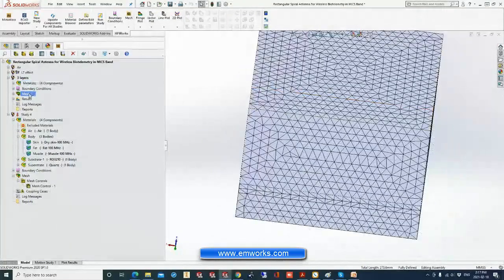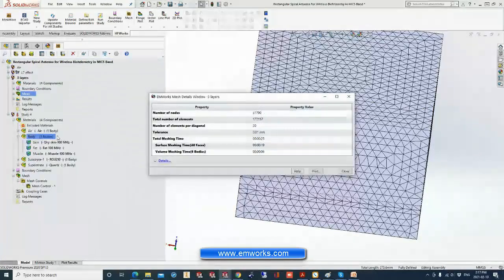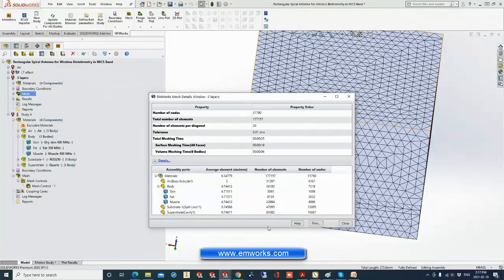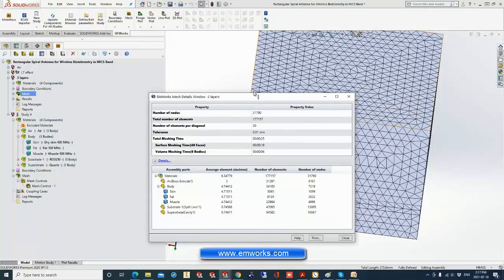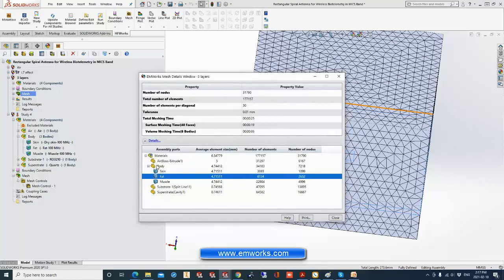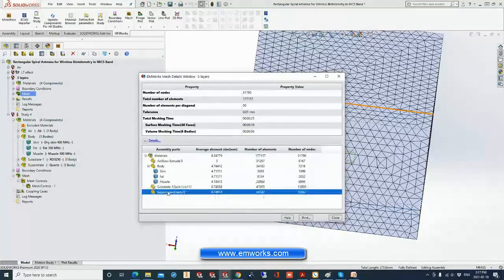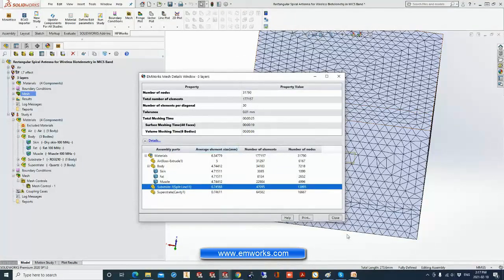So this is the model meshed, and this is the mesh details. It's the total number of nodes, 31,000, and the total number of elements, 177,000 elements. And also you can check more details about the mesh. We have some number of elements related to each body. You can check here the number of elements, for example, on the substrate below or any other part.